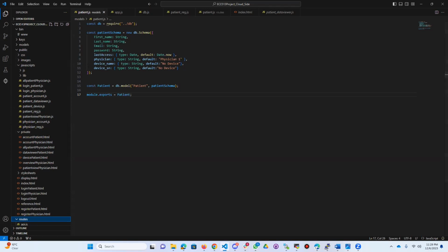In this project structure, the HTML files in the public folder serve as the front end of the web application, defining the structure and layout of the pages users interact with. The CSS files in the public folder provide styling to enhance the visual representation of your HTML pages. JavaScript files in the public folder contain client-side logic, handling user interaction and dynamically updating the content of the pages.